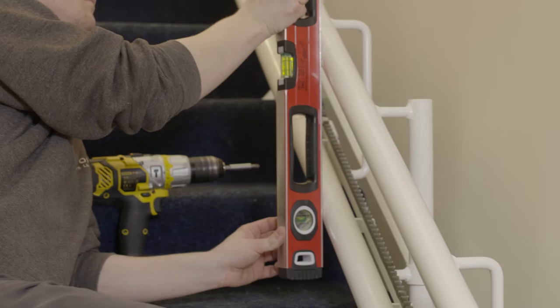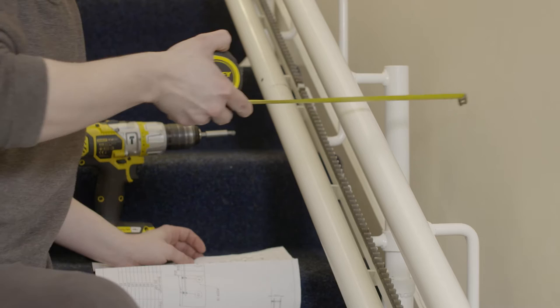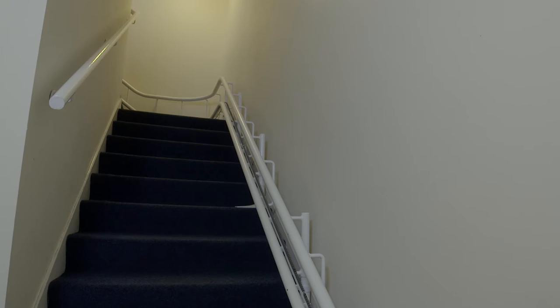Once the stairlift rail is complete, double check all rail heights, clearances and angles, and that the lower and upper rails are vertically level. Finally, ensure rail to wall measurements match the installation drawing.